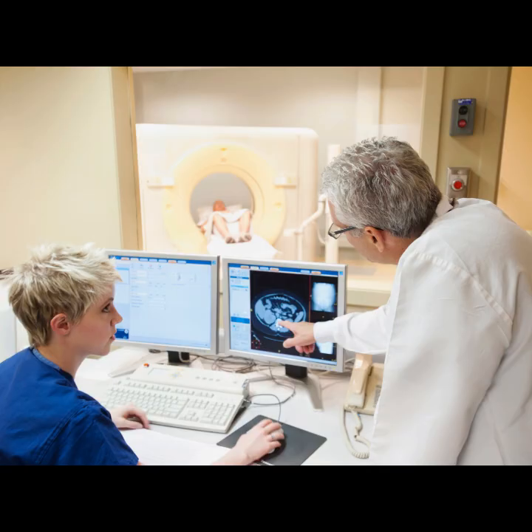They work. They work, sure, but the dynamic approach minimizes the initial error. By treating K-space acquisition as this dynamic optimization problem solved by, let's say, a neural ODE, which conceptually is really just AI learning the absolute fastest and most efficient way to navigate the physical constraints, we condition the trajectory to inherently minimize structural artifacts from the get-go.